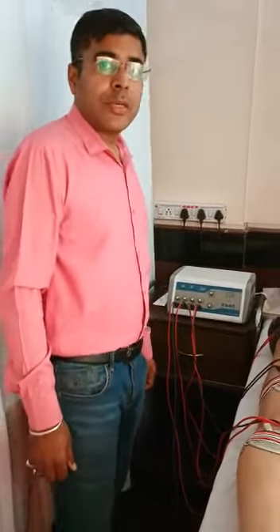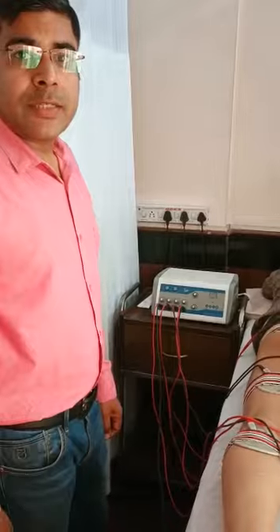Hello, I am Dr. Sushrut Gupta. I am a physiotherapist and today I am going to discuss with you the Transcutaneous Electrical Nerve Stimulator Machine. In short, it is called TENS.